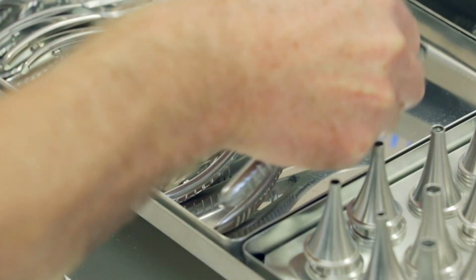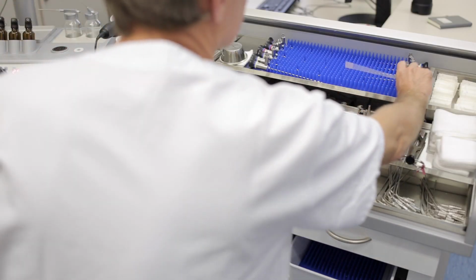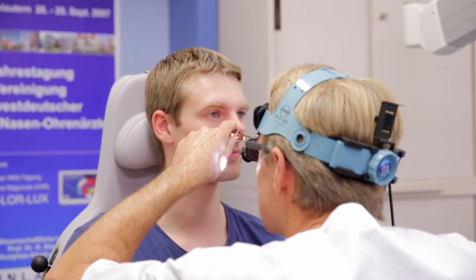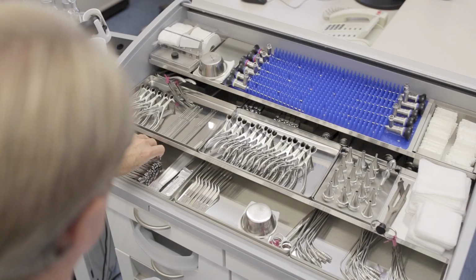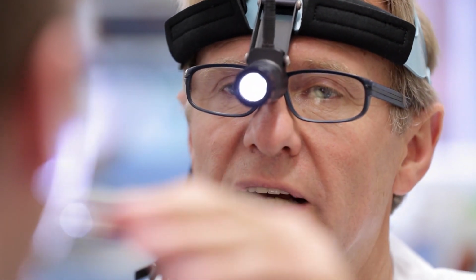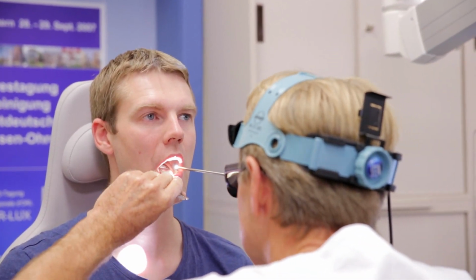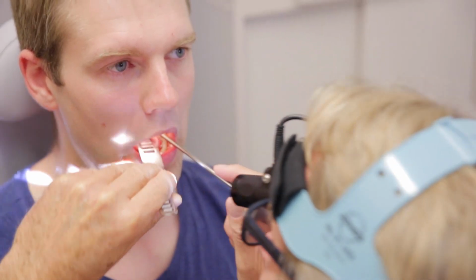The endoscopy of the inside of the nose takes place both with the headlamp as well as by means of rod lens optics, which allow closer inspection of pathologies. Subsequently, the oral cavity, tongue, and oropharynx are examined. It is important to assess poorly visible mucosal areas, for example, in the rear floor of the mouth or in denture users. With the help of an angled rod lens, the nasopharyngeal zone can be inspected very reliably.